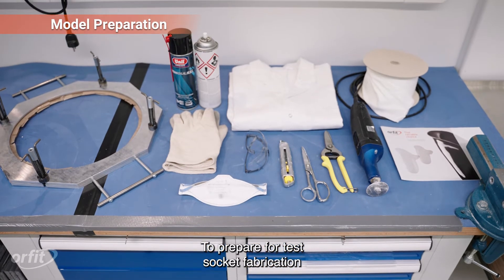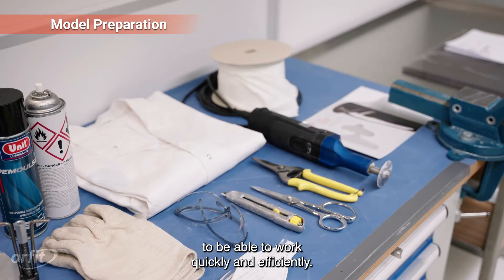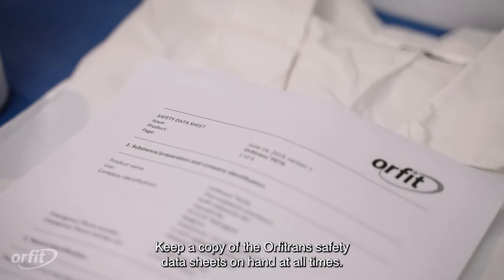To prepare for test socket fabrication, ensure that all necessary tools are within reach to be able to work quickly and efficiently. Keep a copy of the Orfitrans Safety Data Sheets on hand at all times.